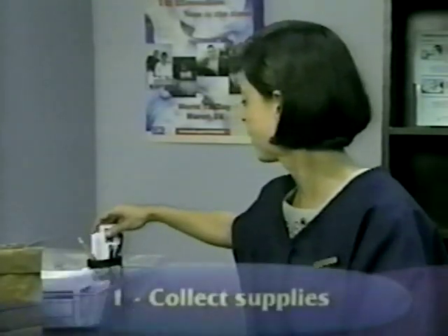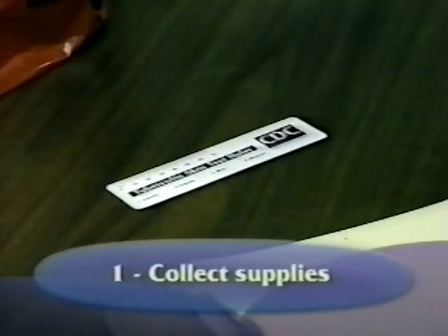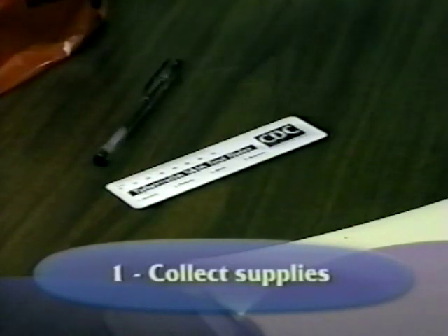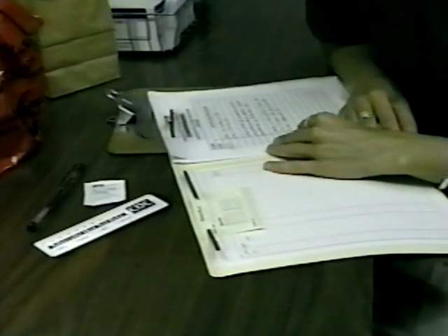To begin, collect the following supplies: a small plastic flexible ruler marked in millimeters to measure the test, a pen to mark the edges of the induration, and an alcohol pad to clean off the pen marks.